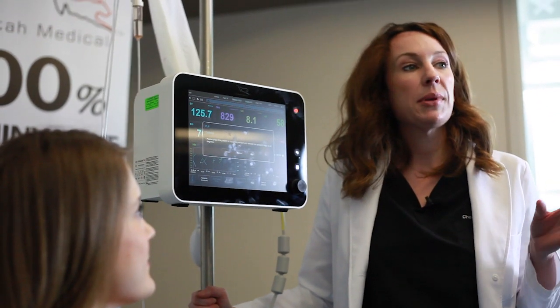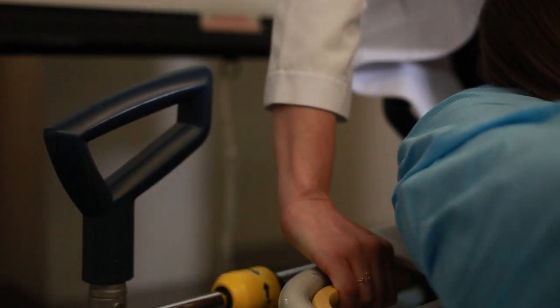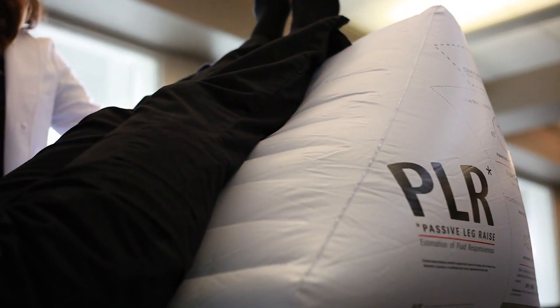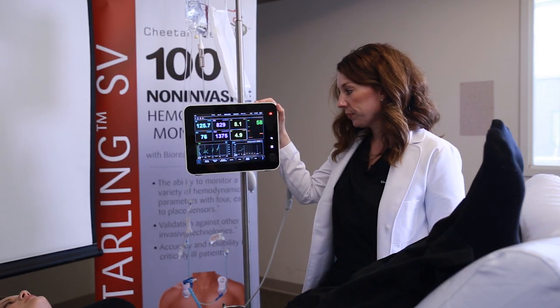Okay, so after the PLR baseline is complete, there's a pop-up that tells us it's time to put the patient supine and elevate their legs to 45 degrees. So we're going to position the patient first, and then we're going to come back and select next. So now we're going to go ahead and hit next.